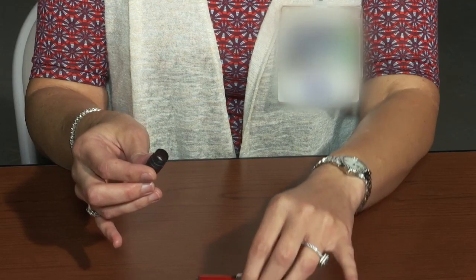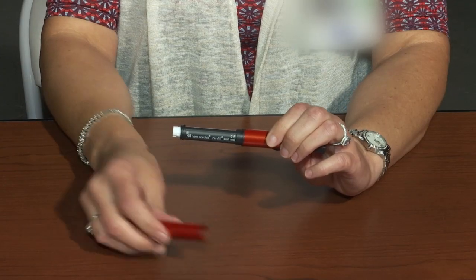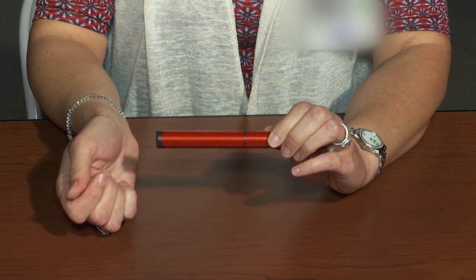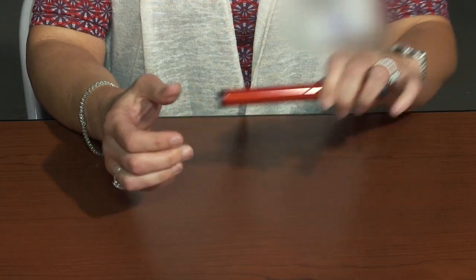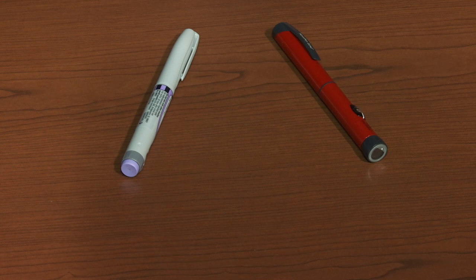Twist the cartridge frame back into the pen, replace the protective cap, and store the pen at room temperature until ready to use. Whether you are using a pre-filled disposable pen or a reusable pen device, the procedure for injecting the insulin is the same.